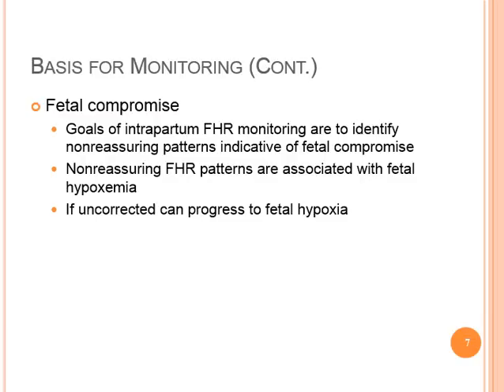So some of the non-reassuring fetal heart rate patterns that you'll see and that we're going to talk about are your decelerations, your late decelerations, your variable decelerations, your prolonged variable decelerations, and we're going to talk a little bit about the sinusoidal fetal heart rate pattern. Those are all abnormal or non-reassuring patterns.